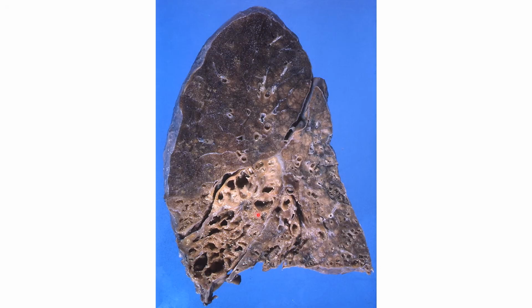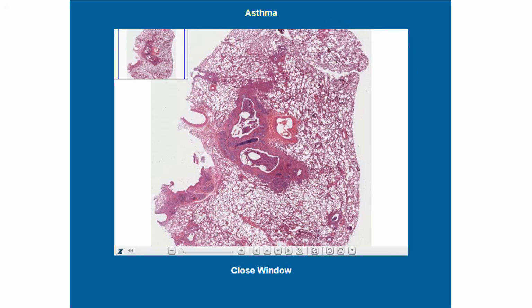This means there's dilatation of the distal airway, and surrounding this tissue is consolidation. You can see the difference of the tissue up here and here. This is quite airy, and this is very dense, and this is what we call consolidation surrounding the dilated airway. Features of bronchiectasis.